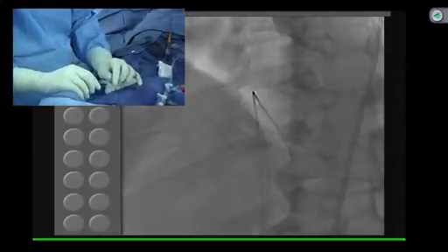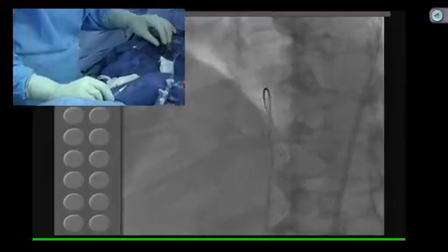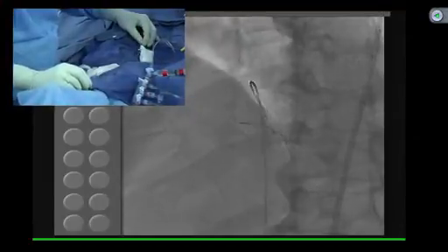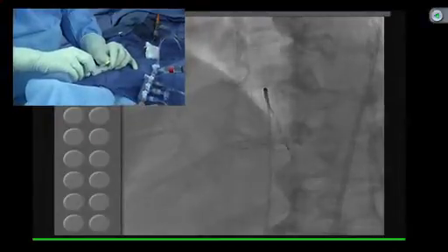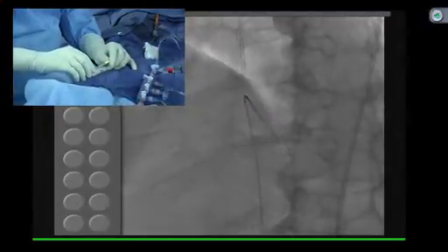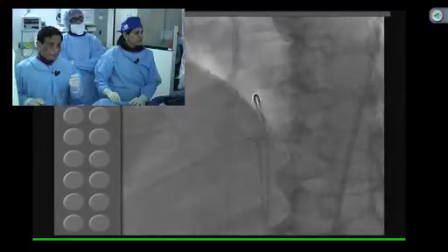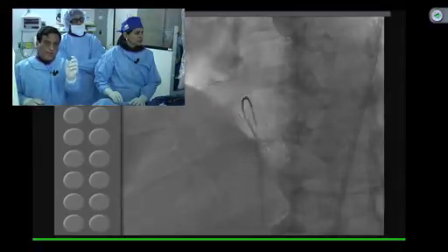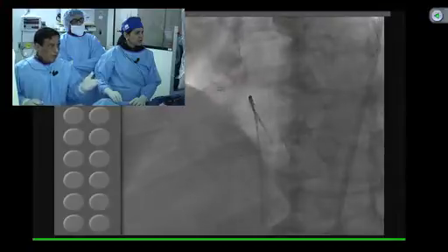For the LAD, you used AngioSculpt for the in-stent restenosis. Is that something you're doing very commonly? Yeah, the reason is either AngioSculpt or a cutting balloon. The logic behind it is that many times they require high pressure for this intimal hyperplasia. Many times in-stent restenosis is focal, from an unexpanded stent. So you need a high pressure or debulking.